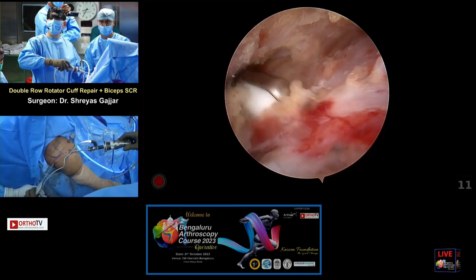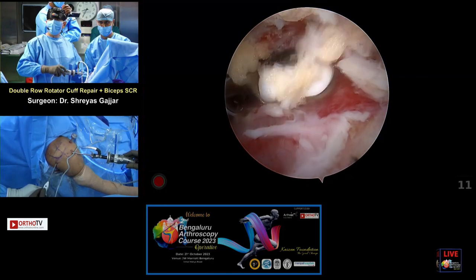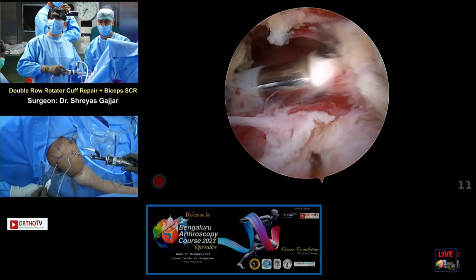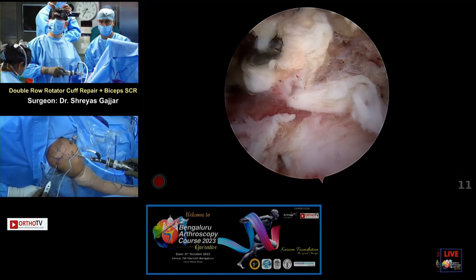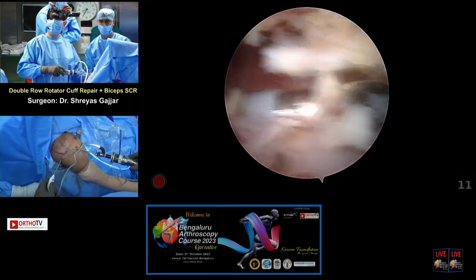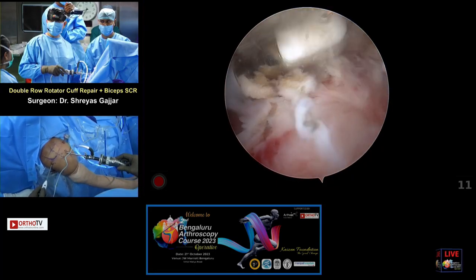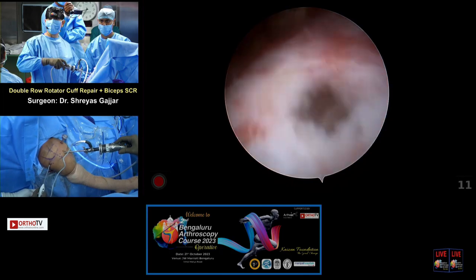So will you be making another posterior lateral portal to change the scope? I'll be making a lateral portal, to decide whether I need one. When I do a double row, I need an additional posterior lateral portal. And if I end up doing a single row, then I don't need that, unless for suture management or passage.